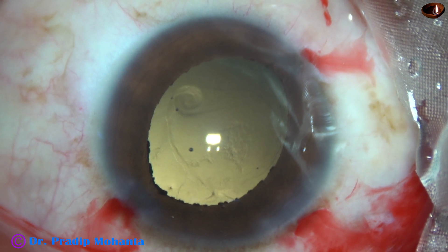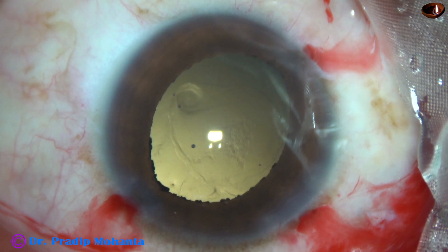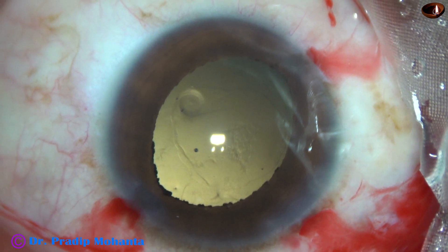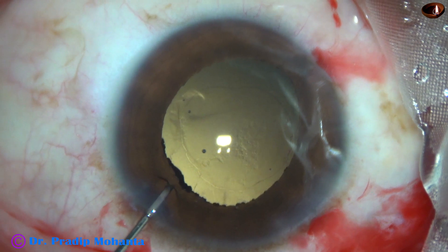Quite a good rexis for this case. I didn't expect that this rexis would be possible.